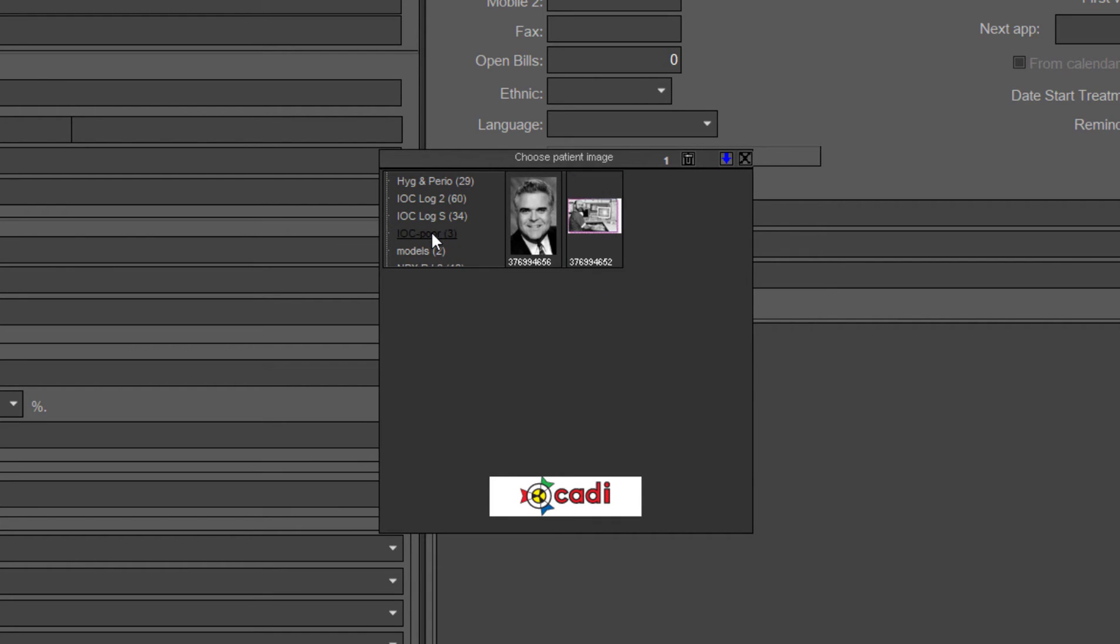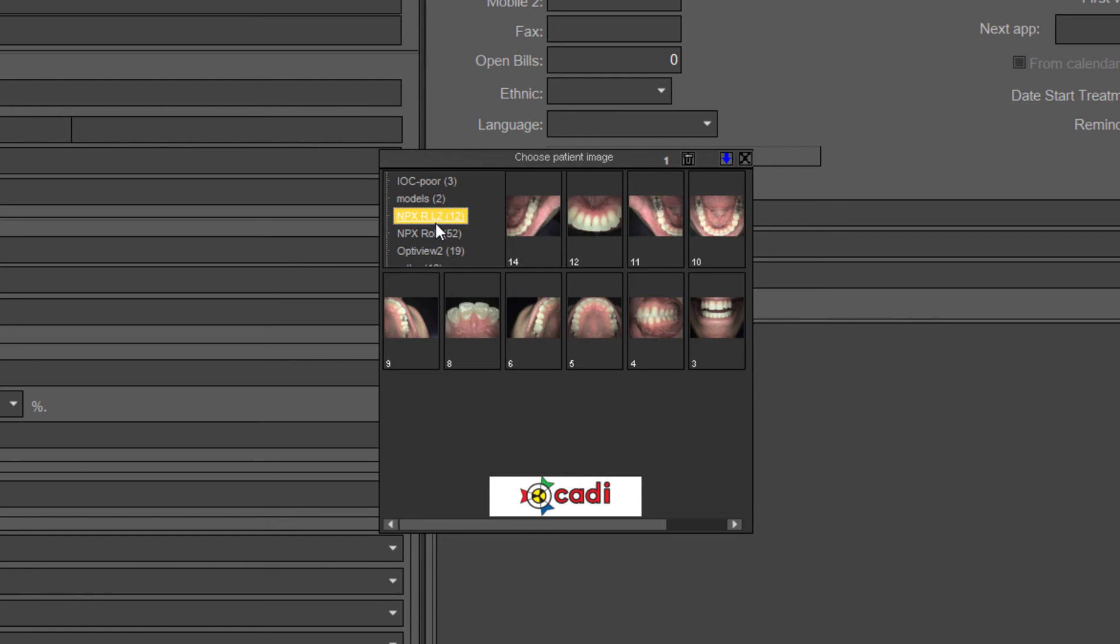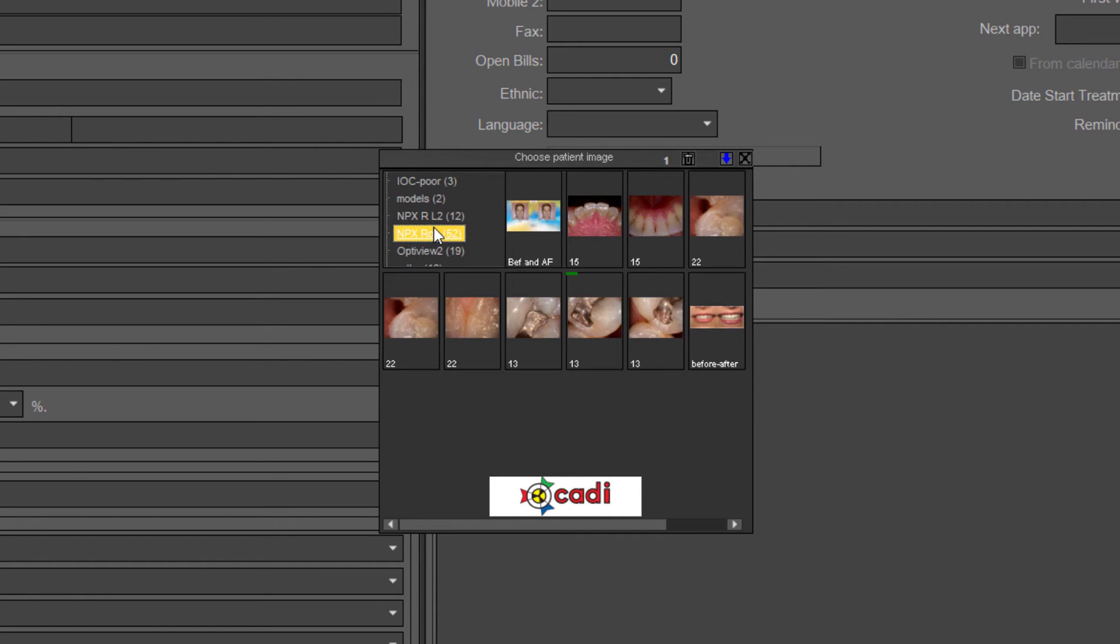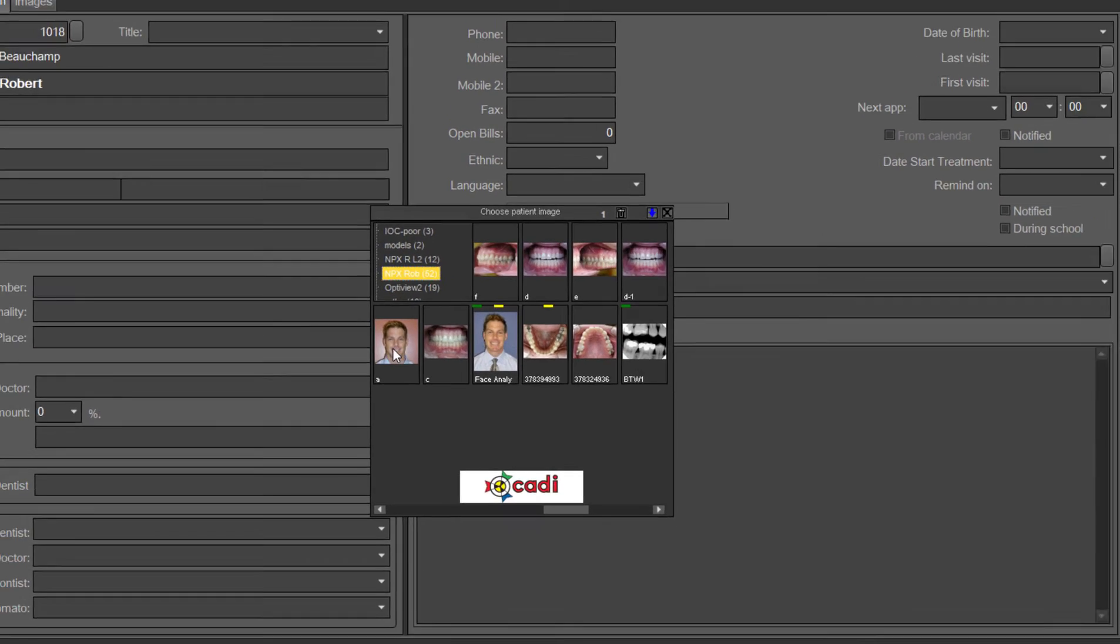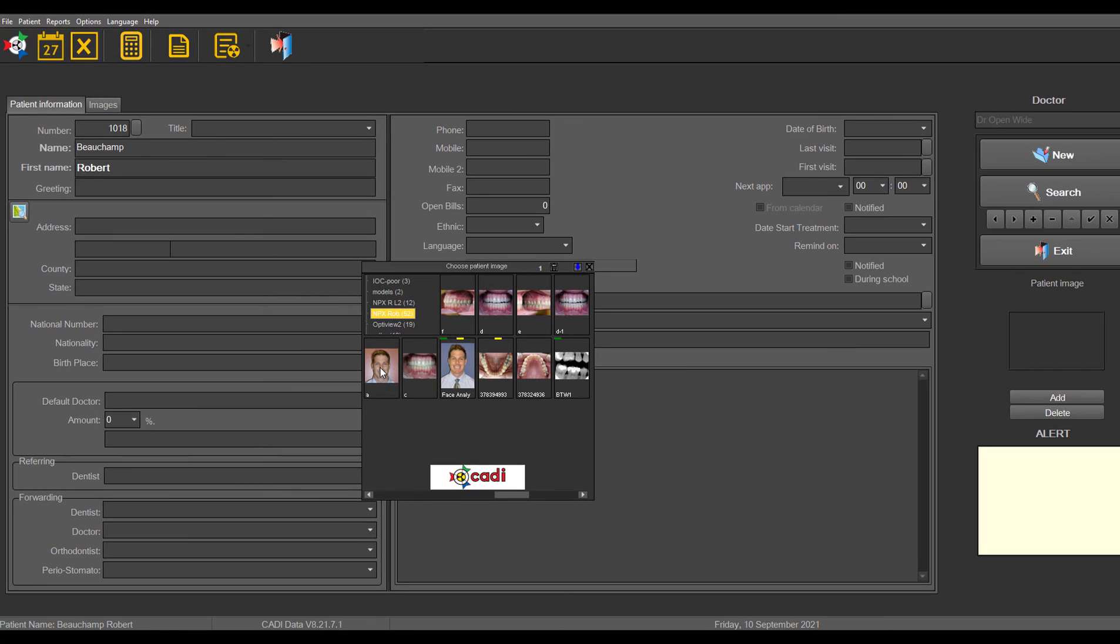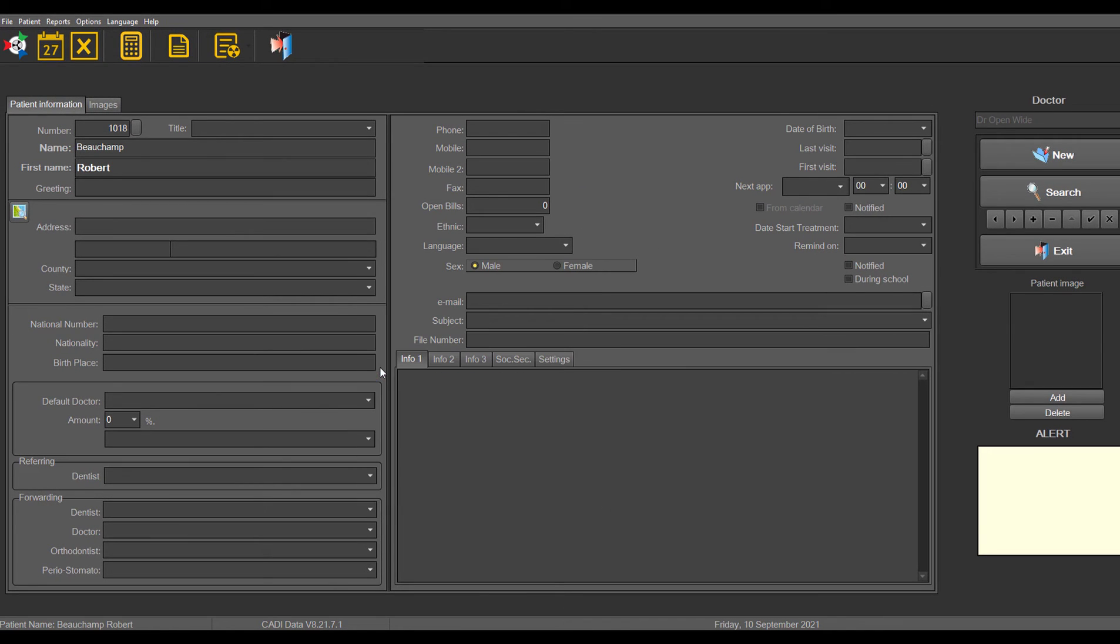If you want to find the right picture for the patient, something like a full face type of shot that you want to pick from the patient's file, you just double click on it and it will place it in there.